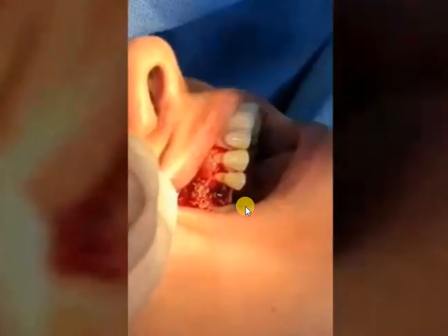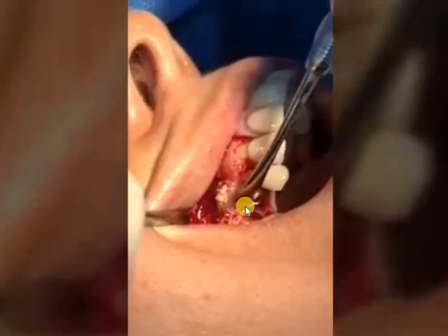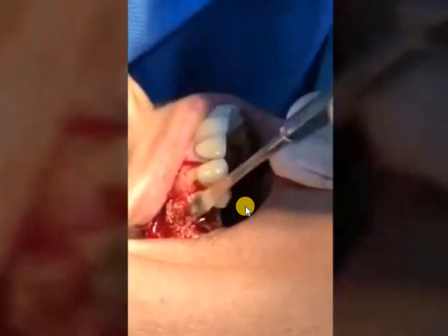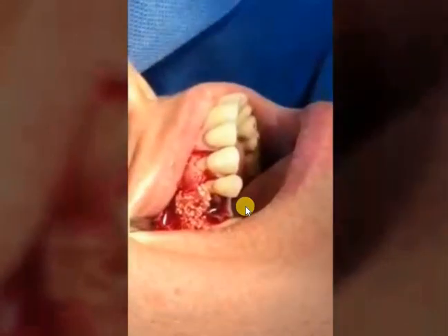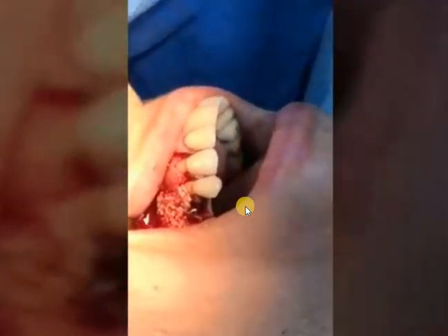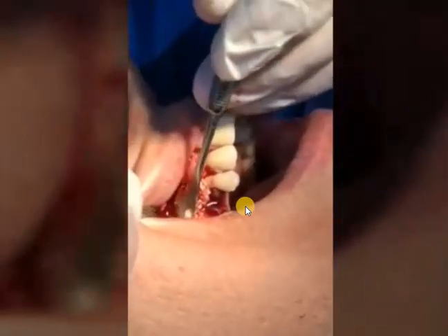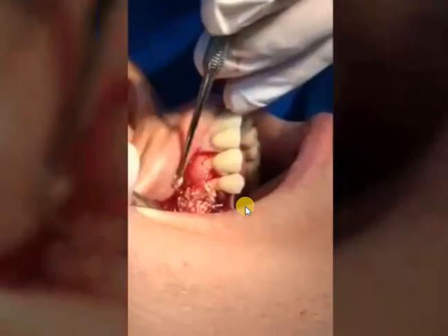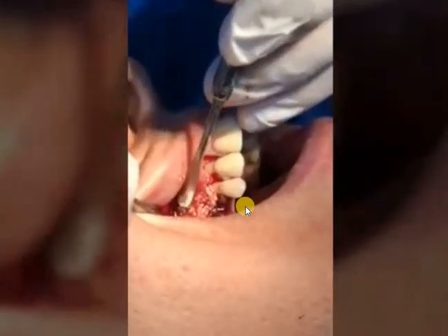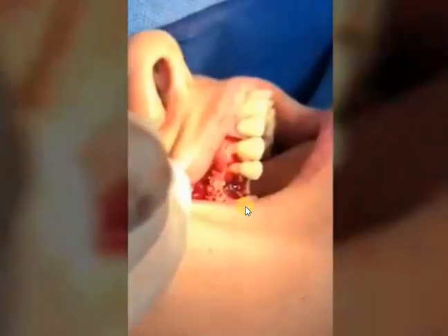Here we are placing the bone graft around the buccal plate. We make small holes using a large round bur on the walls of the buccal plate to improve retention of the bone graft material we are placing. After placing and molding the bone graft and placing a sufficient amount, we proceed to the next step.